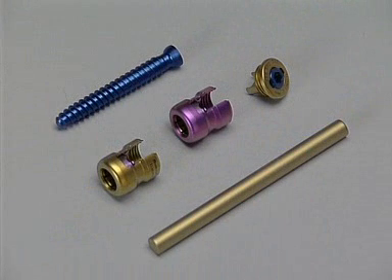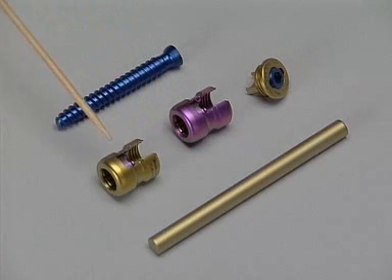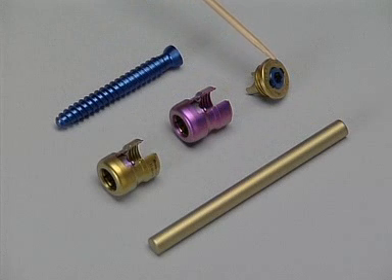The implants needed are Cliquex pedicle screws with a dual core and double thread, Cliquex 3D heads — colored purple for demonstration purposes — and Cliquex 6-millimeter rods. Also required are Cliquex locking caps with an inner 3.5-millimeter hexagonal screw.